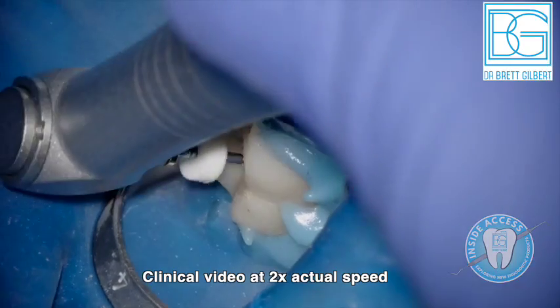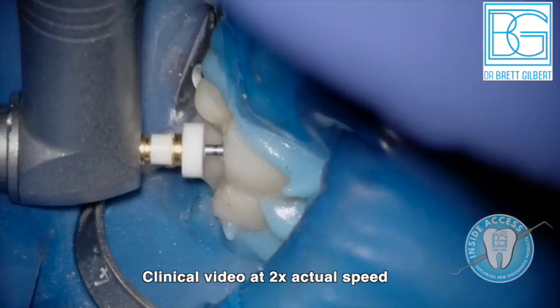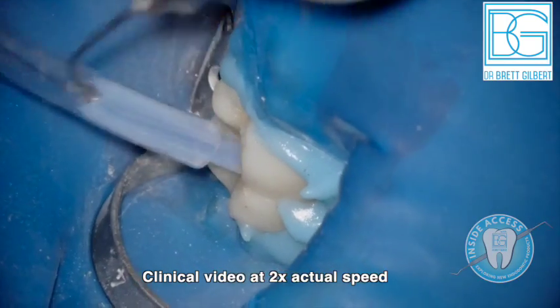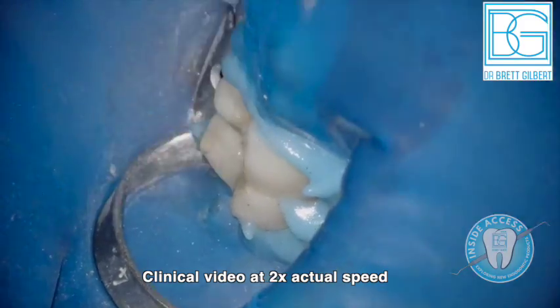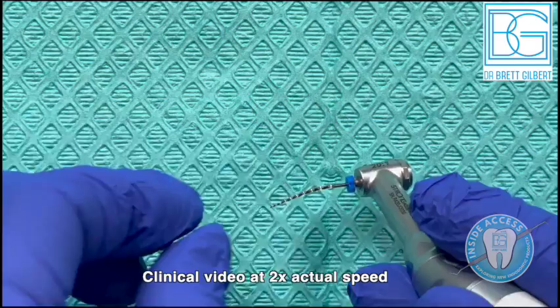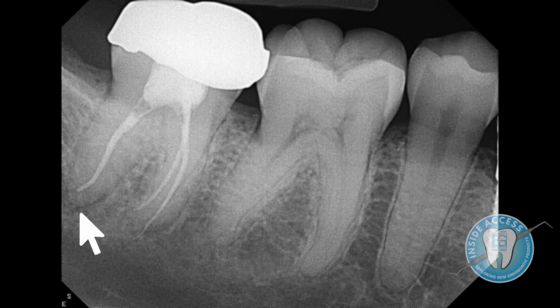Now we have the S2 at 18/04 — the path has already been created, so this is essentially just enlarging with a subtle change from 17/03 to 18/04. Always irrigating. Then the F1 at 20/06, followed by F2 at 25/06 if needed to continue preparation, F3 at 30/06 if needed, and F4 at 40/06 if needed.